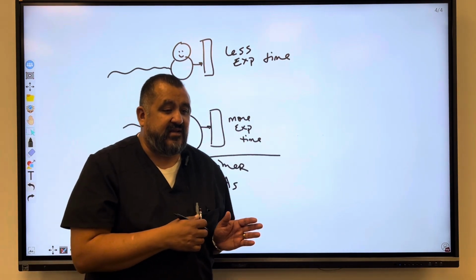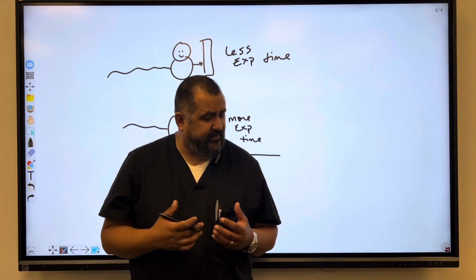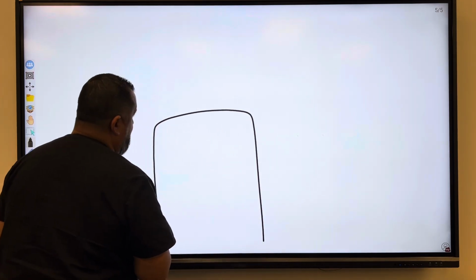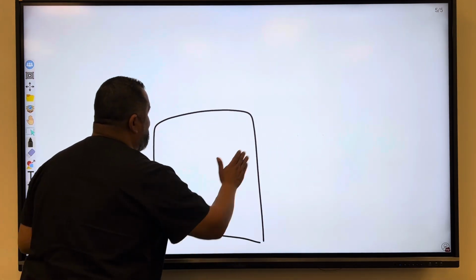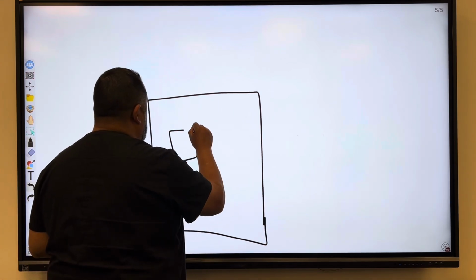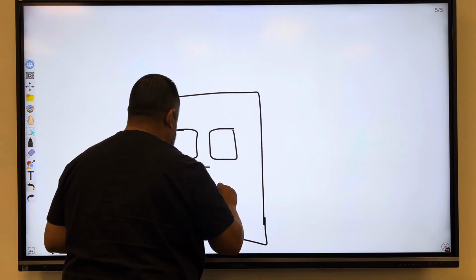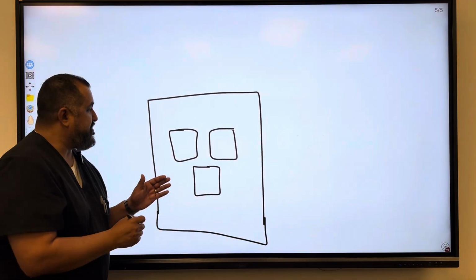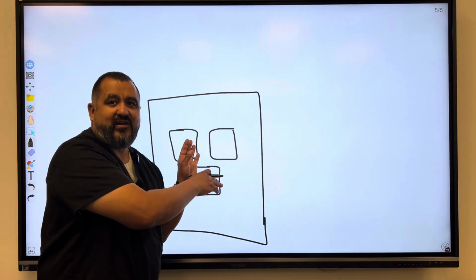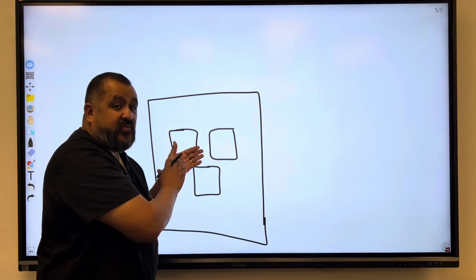Now, how exactly does it work in terms of configuration? Well, I'll tell you, if I was going to do an x-ray on my chest, all right, that's a terrible IR, huh? Let's do it again. Let's say you're going to take an x-ray of my chest, and you had these little squares that look like this. What you would do is these little symbols are representing where the detectors are. So your ionization chambers would be there.